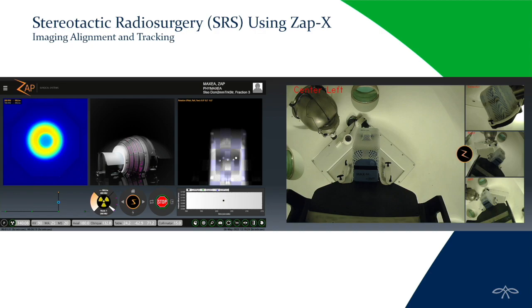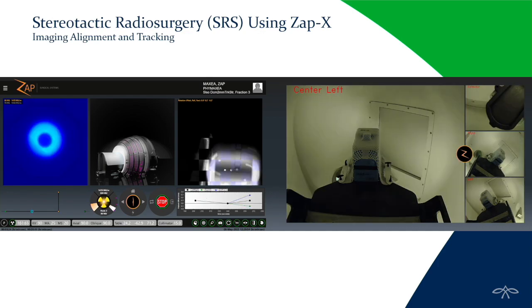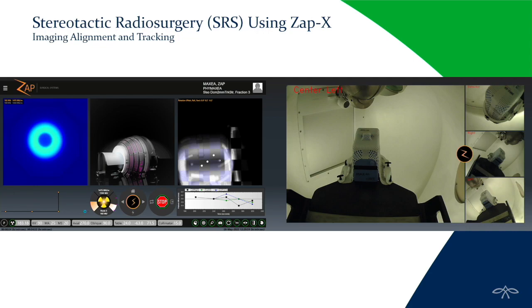You then start delivering on the left-hand side. I believe that's the left hand for you. You see the live MV imaging of the Winston-Lutz target ball, but you also see in the bottom right corner here, in the white area, the plot of the real-time imaging shifts. So if we quickly go through here, you can see that it takes an image, moves, takes an image. Now it's moving in all 3 dimensions away from each other. I'm pretty sure my phantom's not moving. I can't guarantee it, but I'm pretty sure it's not moving. It moves again. It moves again. So when people are talking about noise in a system, the noise in the system comes from trade-offs that we're making. So in this case, on a phantom, we're moving about 0.6 of a millimeter as we move around the phantom and take images from different positions. We have a panel right here.